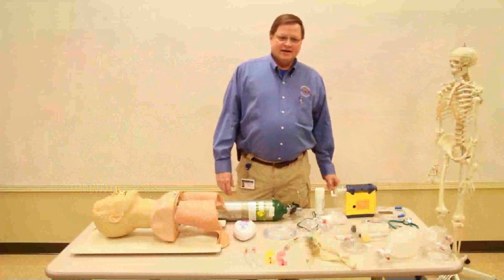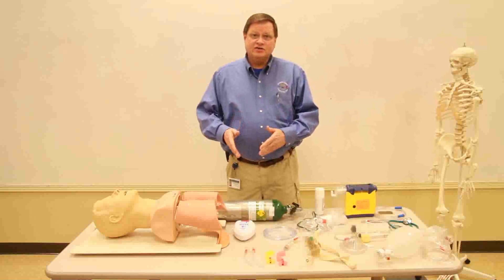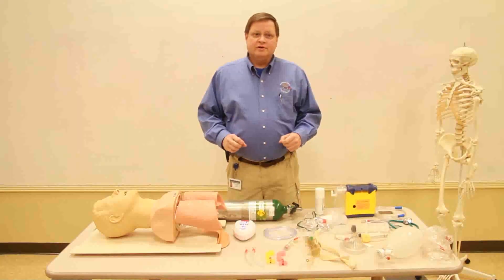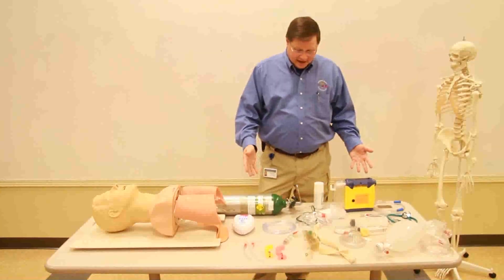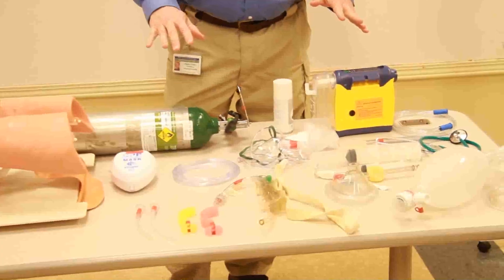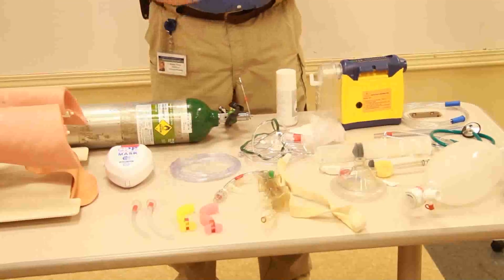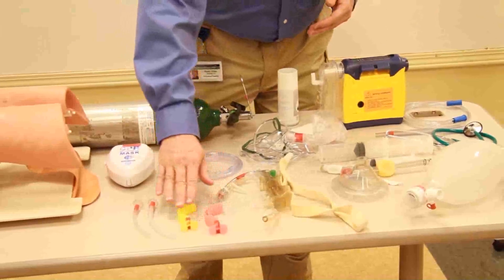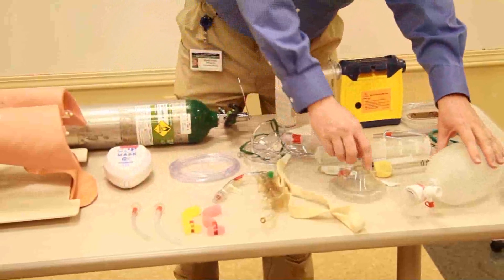Hi, my name is Randy White. I'll be demonstrating the oropharyngeal airway, the nasopharyngeal airway, and the bag valve mask and the ventilatory process. We can see there are a lot of different things involved in airway and airway control. We're going to talk about each one in a different video, but right now we'll be doing the oropharyngeal airway, the nasopharyngeal airway, and the bag valve mask device.